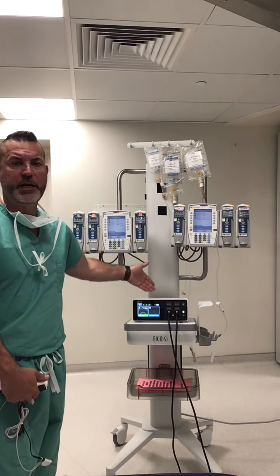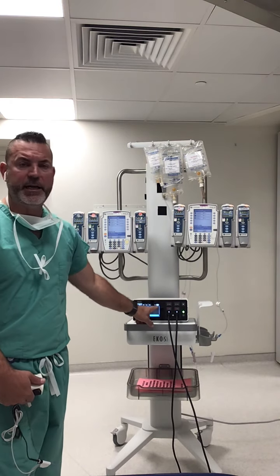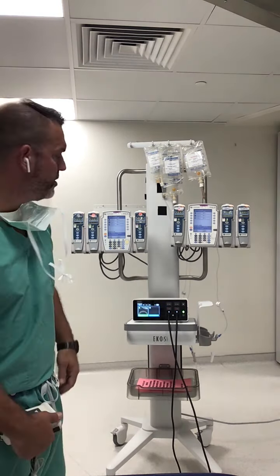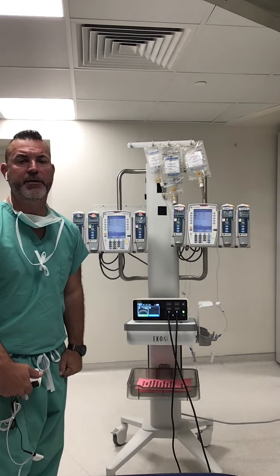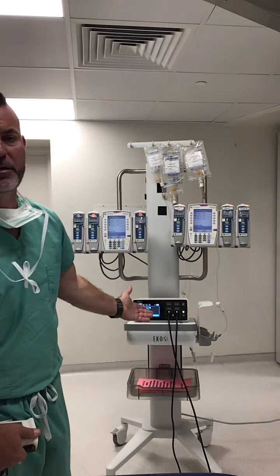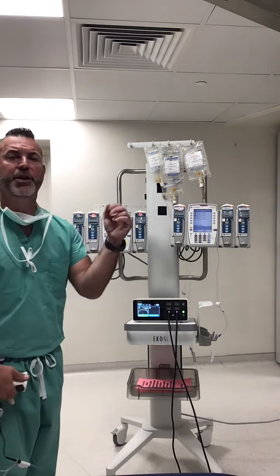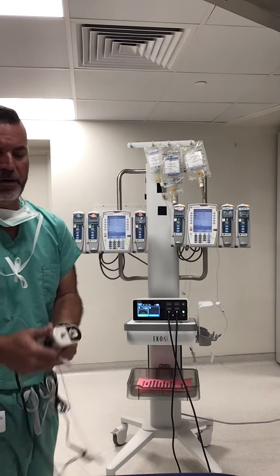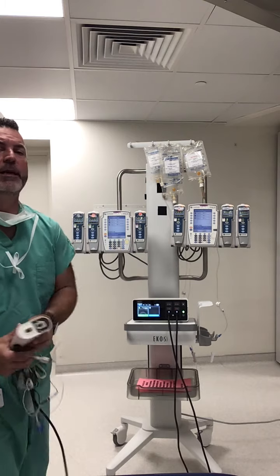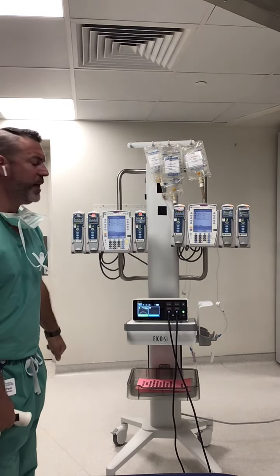There's a couple of other features as well. I told you earlier that we have a lithium-ion battery that's just inside the machine. There's also a battery indicator. It's just like your phone chargers or your cell phones. There is a battery indicator so that you know exactly how much power you have, and guess what? You can transport this off power on your battery. You get 2 hours of transport time on a battery if you're treating 1 EKOS catheter. You get 1 hour of transport if you're treating 2 of your EKOS catheters at one time.